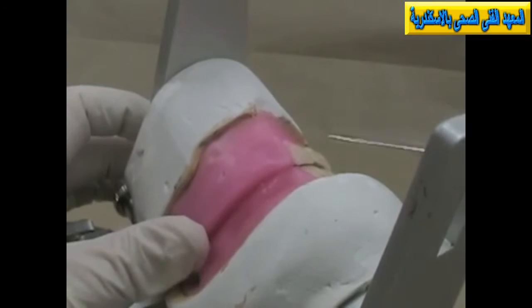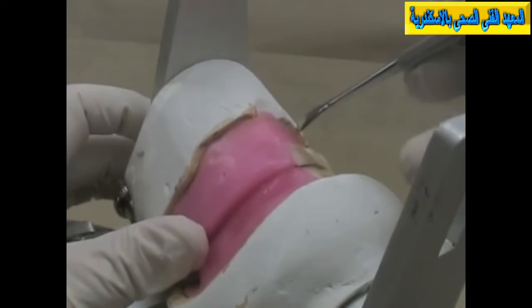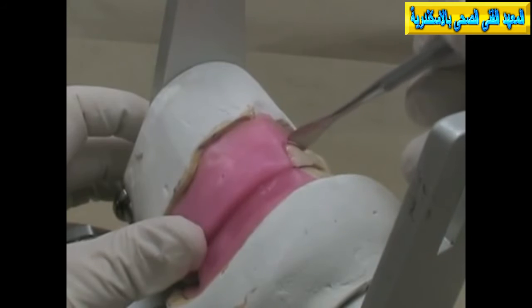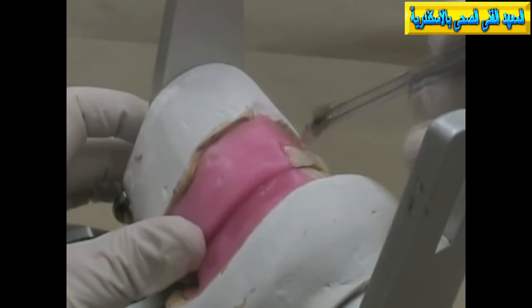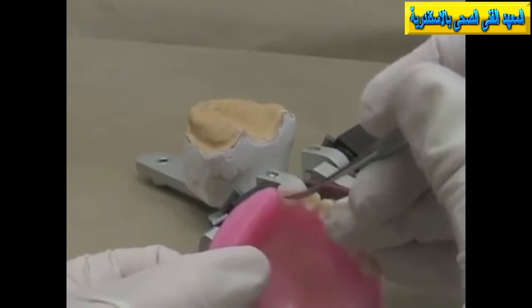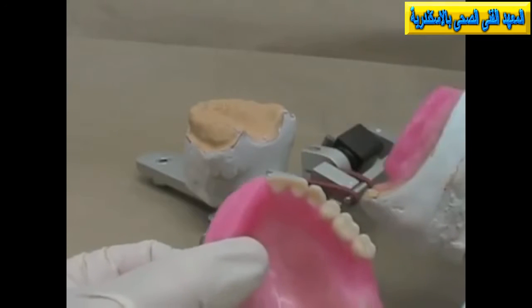I didn't have quite enough overjet on the central incisor, so I'm going to increase the overjet there now just by softening the wax all the way around the central incisor. You can see that as I'm using my instrument, the wax is becoming molten, and I'm going out underneath the tooth so that I've got it good and softened, so I'll be able to move that tooth the way that I want. I'll also soften it a little bit on the lingual surface so that I'll be able to move it buccolingually very easily.